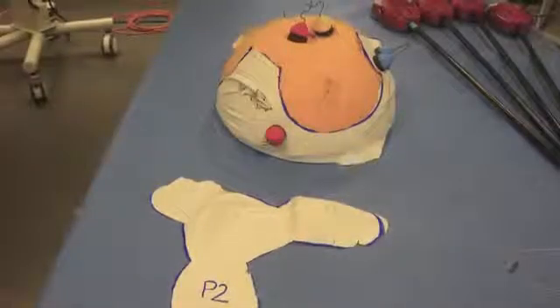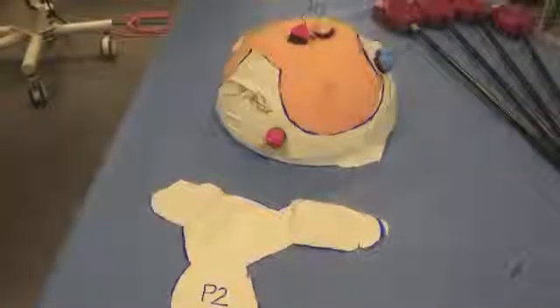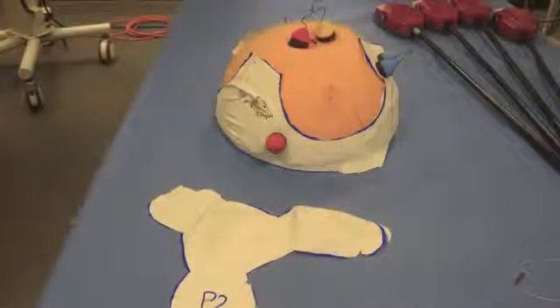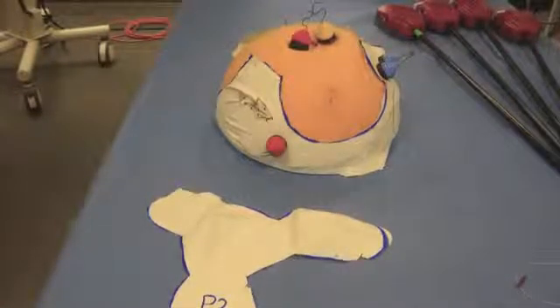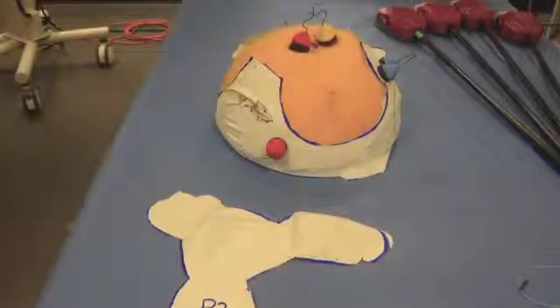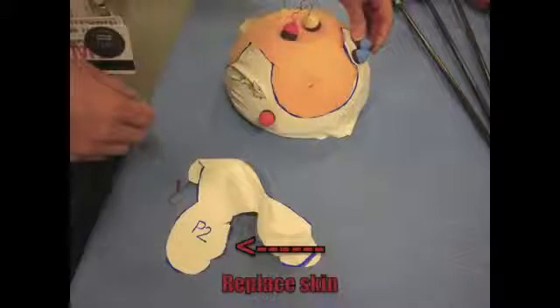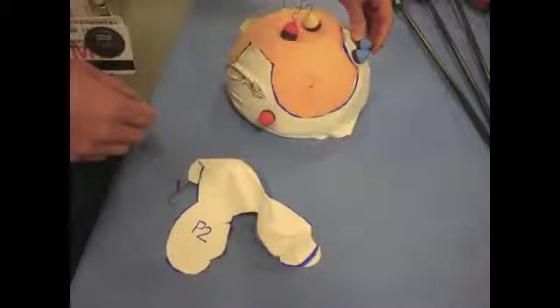These next few pictures demonstrate the model after completion of all exercises. The total time for a novice to intermediate learner to complete all exercises was 15 minutes. This all-in-one model is reusable, and only the skin of the dome needs to be removed and replaced with a new skin for the next learner. Also, magnets were used to allow for easy placement and removal of the cones. The total cost for this model was approximately $15.